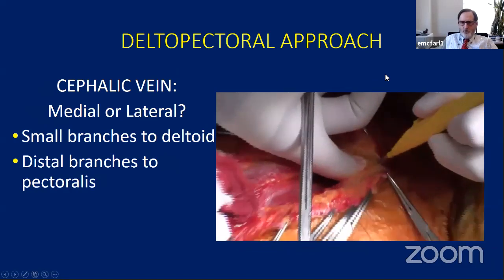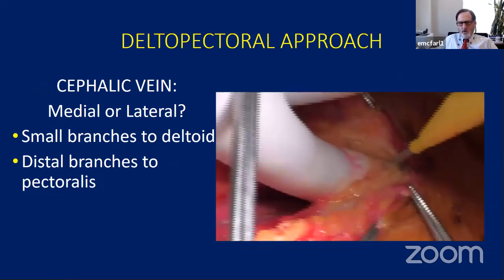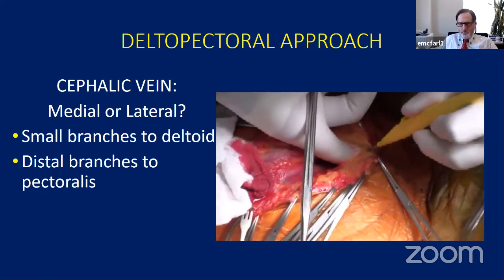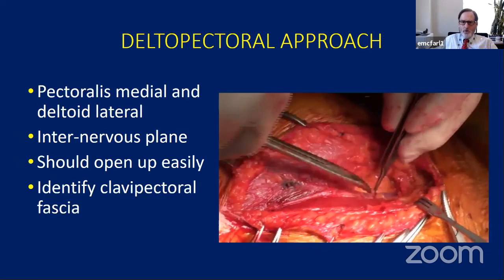So there's all sorts of controversy. It seems like every time you do this approach, everybody wants to know whether you take the vein medial or lateral. I don't think it matters at all. I personally prefer to take it lateral, but here we are just releasing the fascia over the vein so that you can get down into the interval.